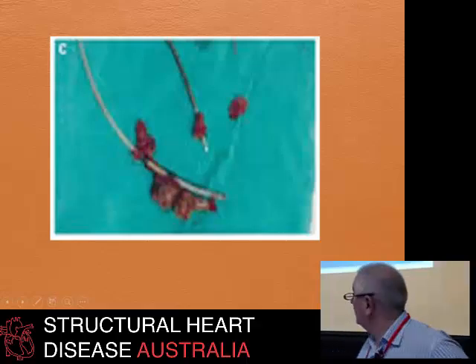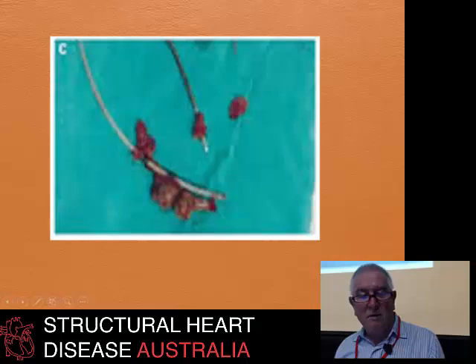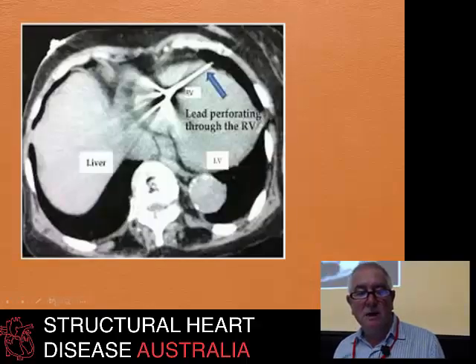So this is the kind of problem that you would hope to identify in your preoperative echo and think about not using a percutaneous extraction, because as you can imagine, as you pull all these out through the subclavian or axillary vein, you're going to lose a lot of these vegetations into the pulmonary circulation, and if they're really quite big, they can have major hemodynamic consequences.